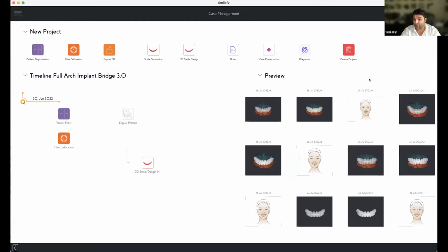Implants can be replaced with temporary abutments. Yes, that's something you can do. In the printed bridge, you can make the holes bigger than they actually are, and then you can print and try, of course.